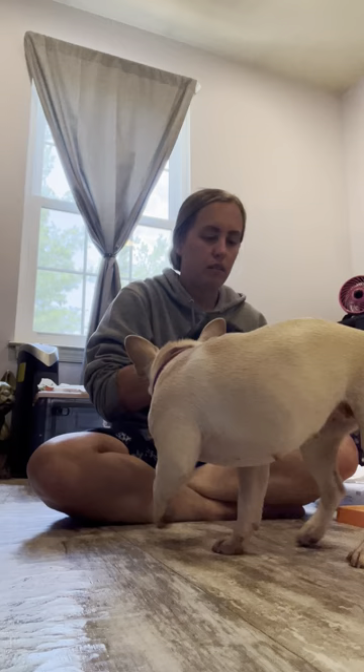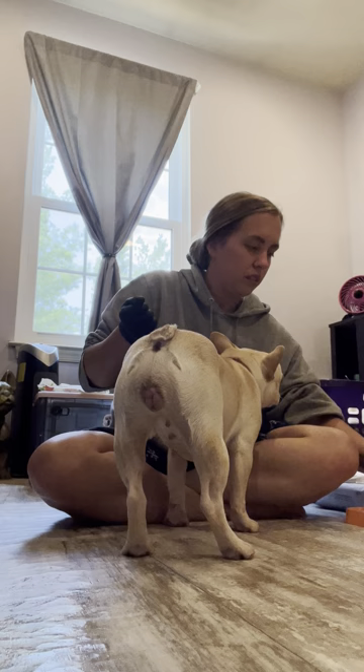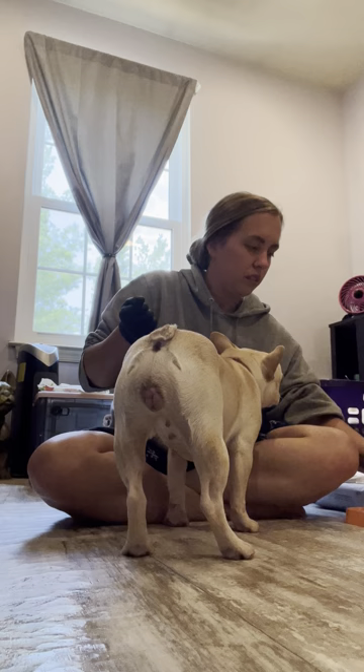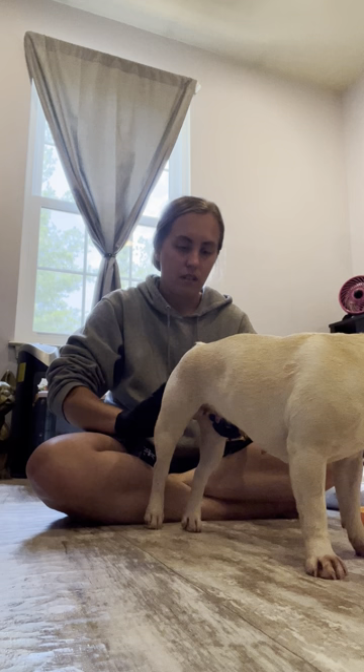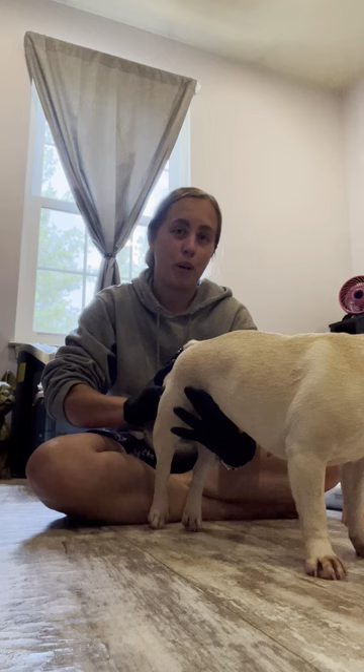Come here, babe. Ready? I gotta lube up. You gonna cooperate with me this time? She was so funny with me yesterday — she lets me put my finger in, but then when I go to put the pipette in, it's like... She's not yelling at me though.